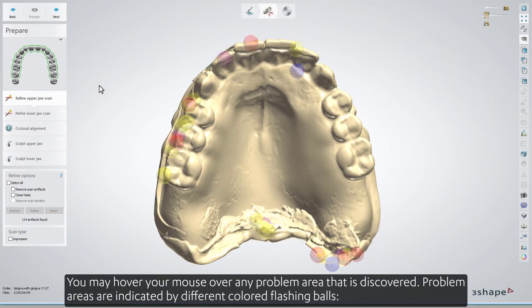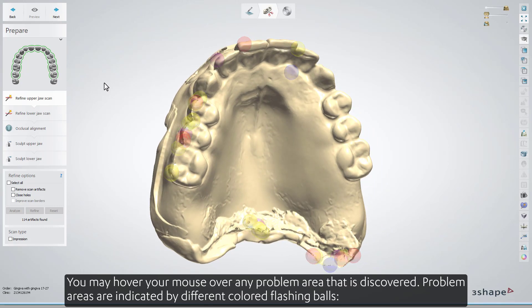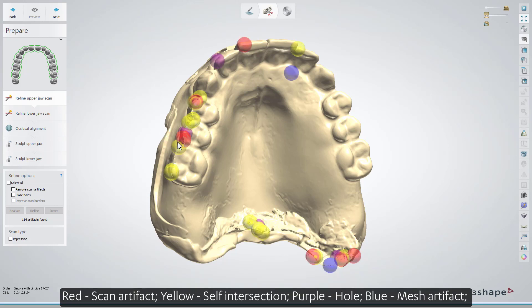You may hover your mouse over any problem area that is discovered. Problem areas are indicated by different colored flashing balls: Red for Scan Artifact, Yellow for Self Intersection, Purple for Hole, and Blue for Mesh Artifact.